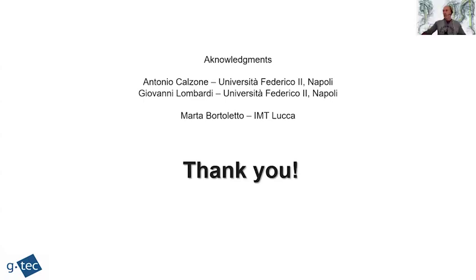Slobby Basileus is asking, can you do such experiments with dry electrodes, or what's the problem? So dry electrodes have a very high impedance. They cannot be measured, essentially. And because they have a high impedance, they are very susceptible to ambient artifacts, and as you can imagine, even more to the pulse artifact from the TMS. In short, the answer is no.